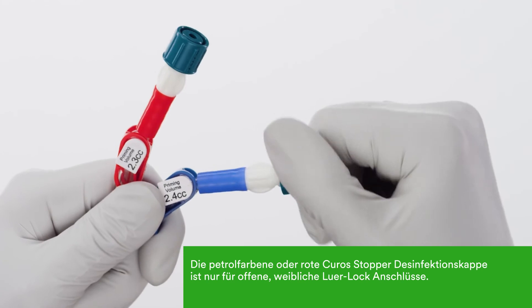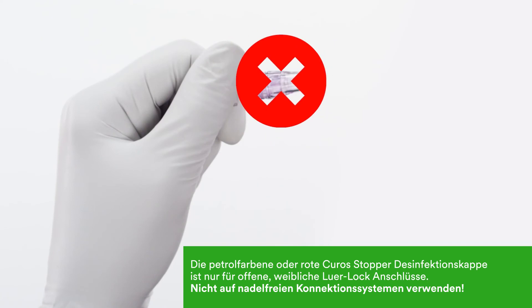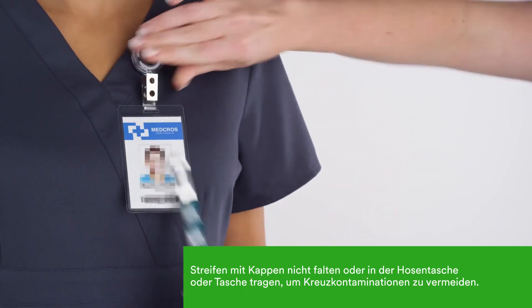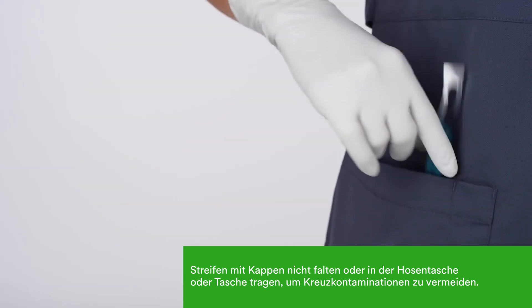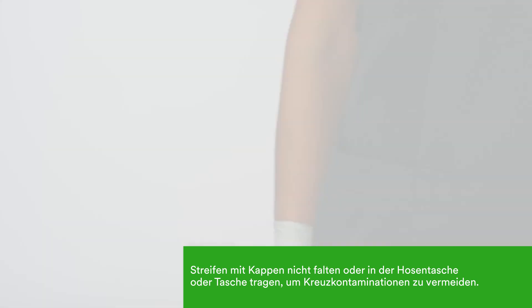This cap is for open female lures only. It will fit a wide range of stopcocks and catheter hubs. Do not use on needleless connectors. To maintain the integrity of the strip, do not fold the strip, wear it, or place it in your pocket. This will also help prevent cross-contamination that could result as you move from room to room.